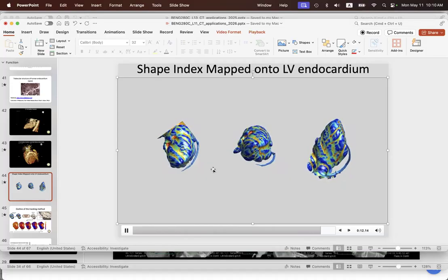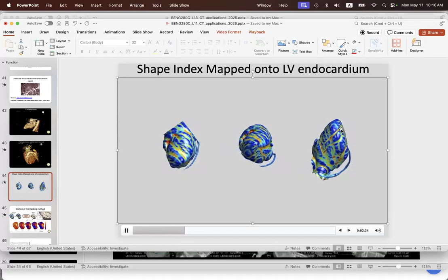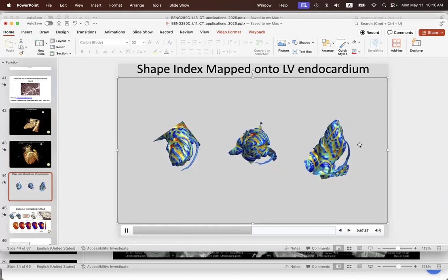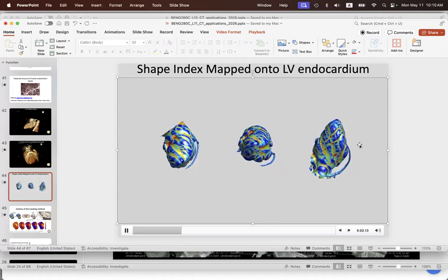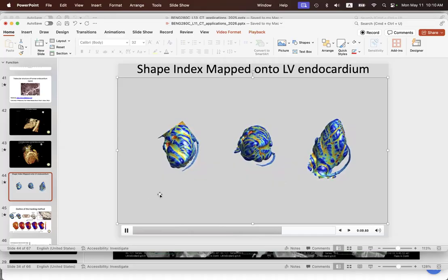And so you can see how these positions on the left ventricle, based on the trabecular structure of the left ventricle, those things actually change and are trackable, right? And so you can link up points on this surface to those features and say, I want you to track with the feature as you try and track these points in time.